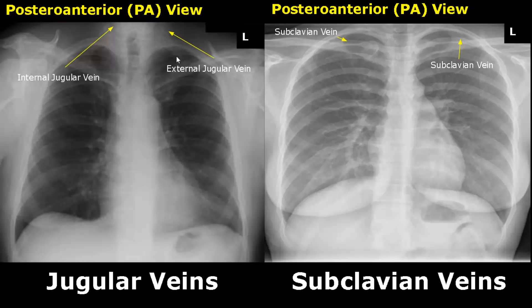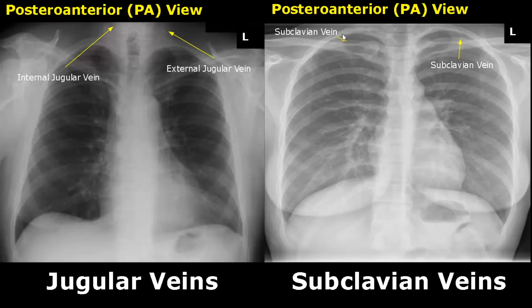This is the location. The course of the subclavian veins will be behind the clavicle on both sides on x-ray. The subclavian artery is also in this region.